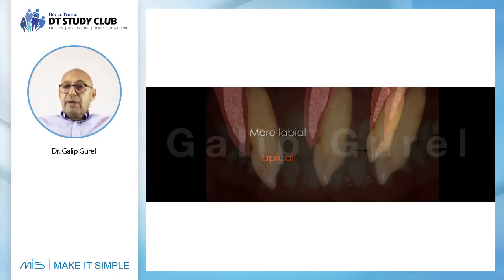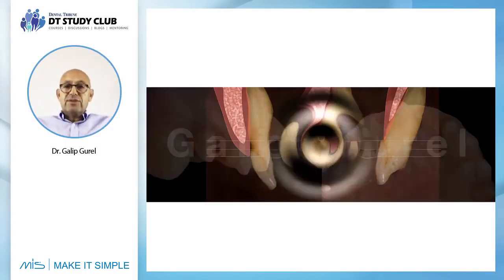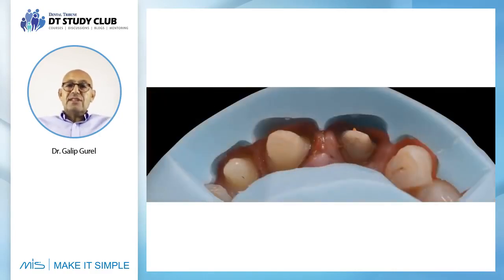So it's the same patient, same tooth, only because of the different positioning, you can see three different heights of the soft tissue. And this is what holds true in this case. Look at the emergence of this tooth from the alveolar bone, and you see the tissue is way up. So what I'm going to do is I will start getting rid of this part to see how the soft tissue will react. This was the decision we took with Eric Van Doren while doing this case.